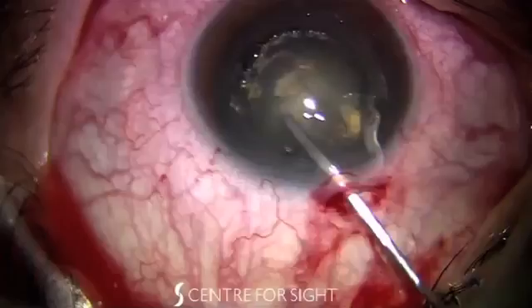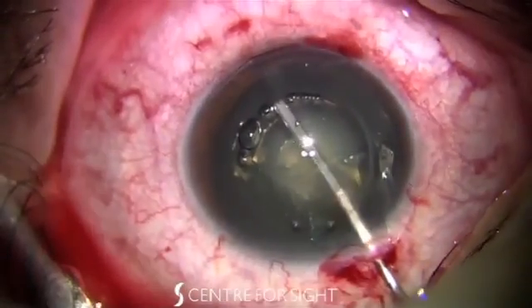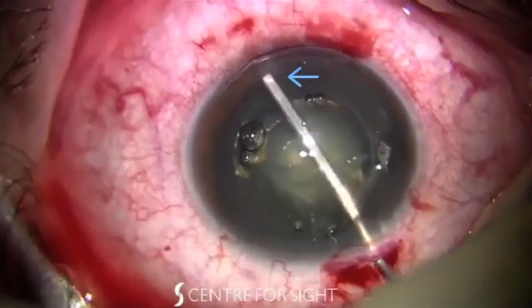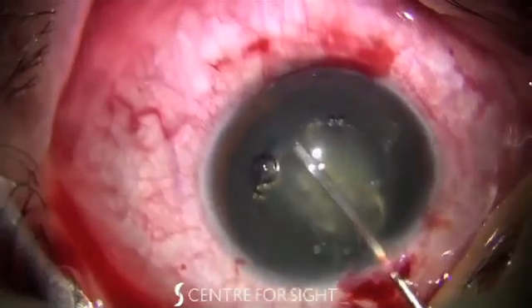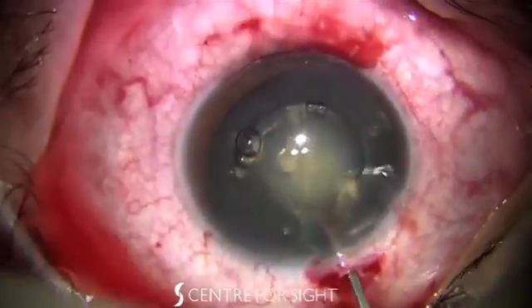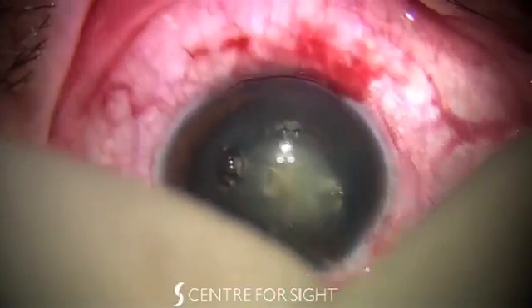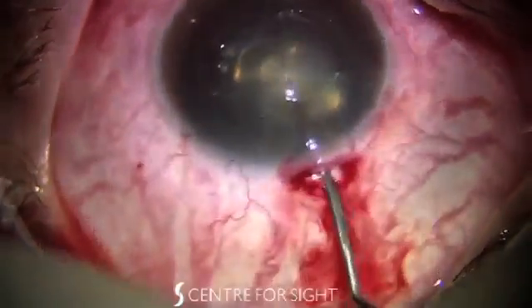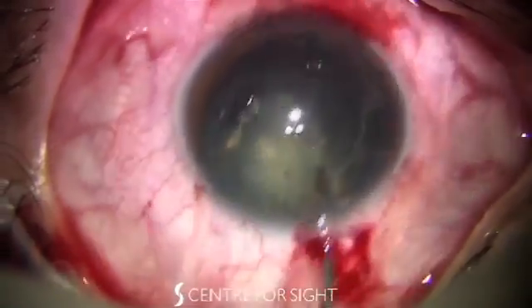This video shows difficulty in passing the hydrodissection cannula immediately under the capsule, with the cannula riding over the edge of the capsule. The cannula eventually does insert under the capsule, and when fluid is injected, capsular block occurs, with fluid accumulation behind the lens and anterior displacement of the nucleus. Notice how the lens pushes up against the anterior capsulotomy, widening the opening. The lens is difficult to rotate and needs to be rocked to release the fluid.